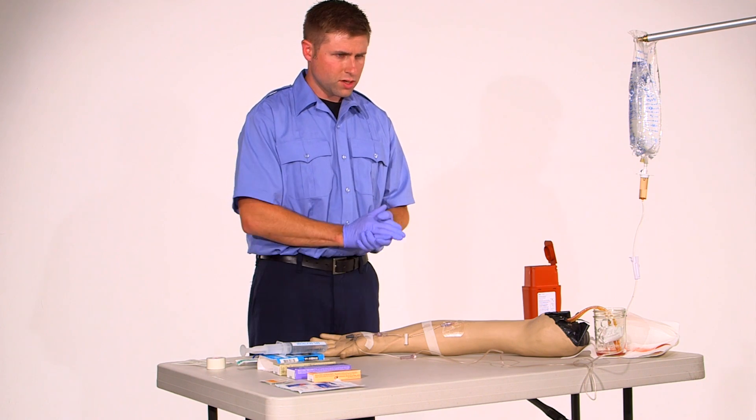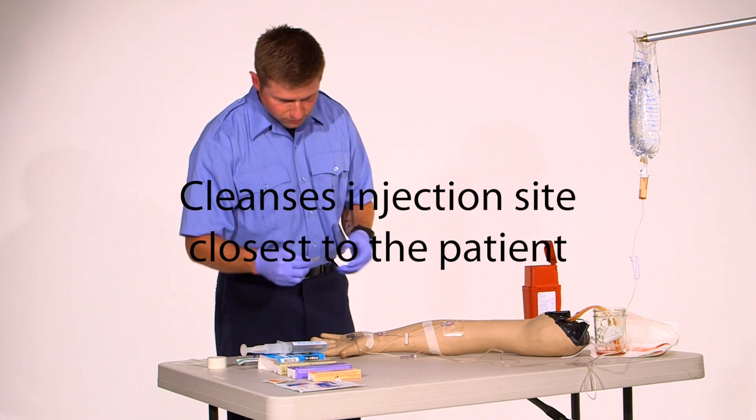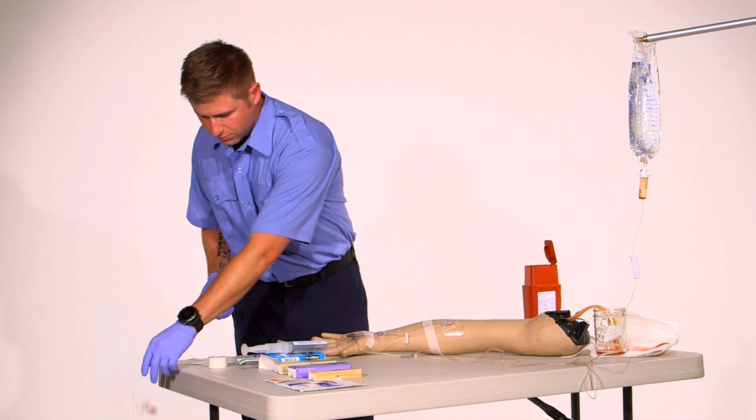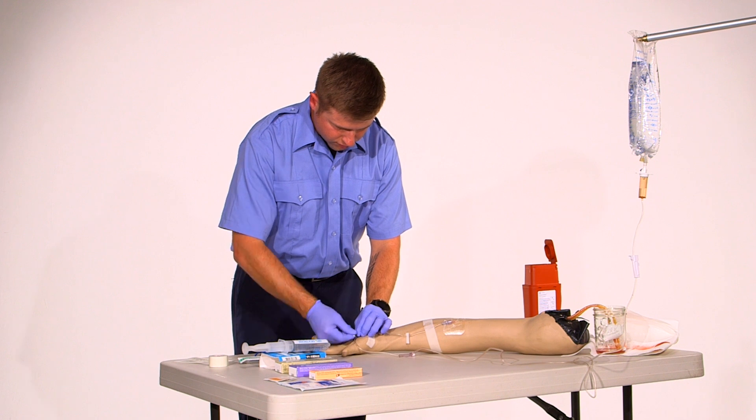I assembled the syringe and I am going to clean the port at this time. So I'll make sure that the port on here is nice and clean.